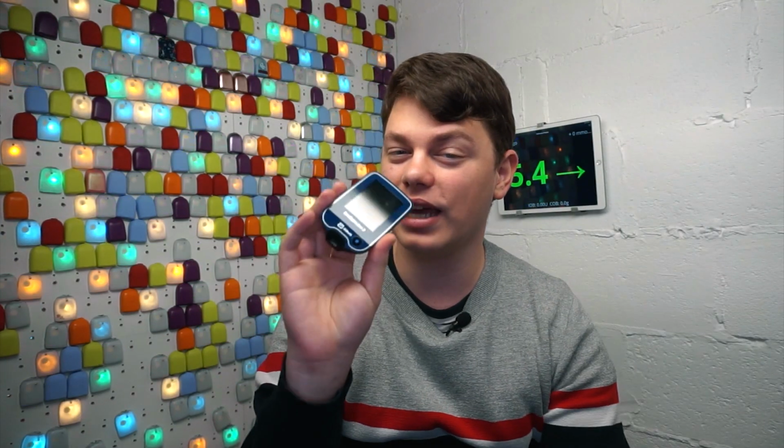And FreeStyle Libre 2 has just been approved as an iCGM in the US. Now, this might sound exactly like the Dexcom G6 approval a couple of years ago of an iCGM, but it isn't. With approval of FreeStyle Libre 2, the US regulator decided to create 2 separate categories, 2 types of iCGMs. And as you guessed it, FreeStyle Libre 2 has a different iCGM category to the Dexcom G6.